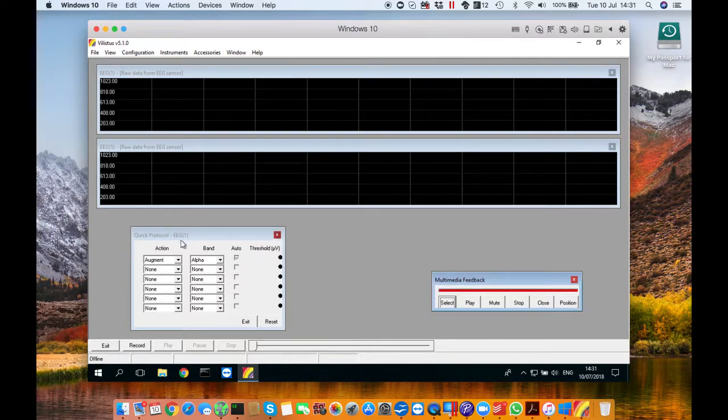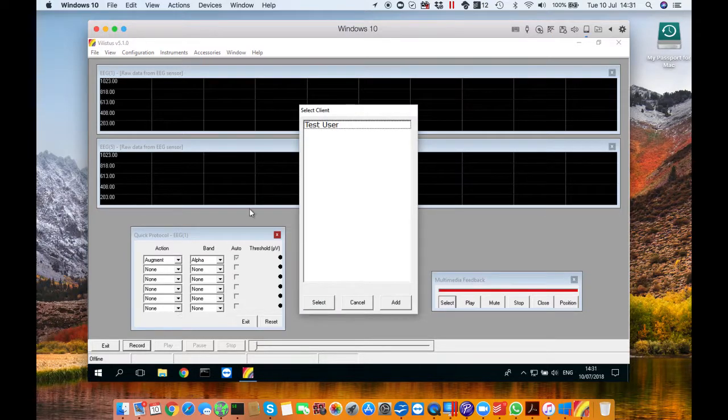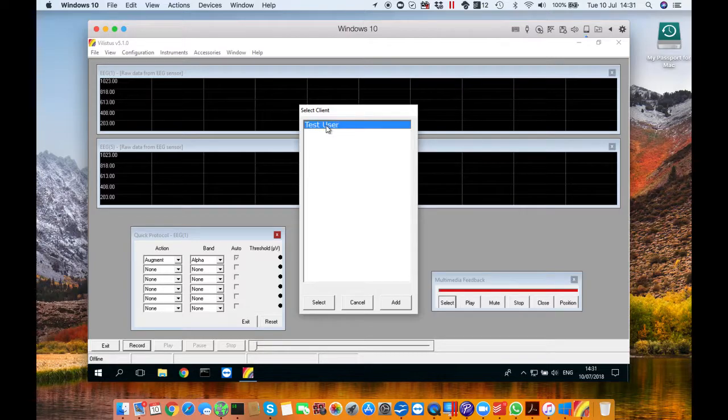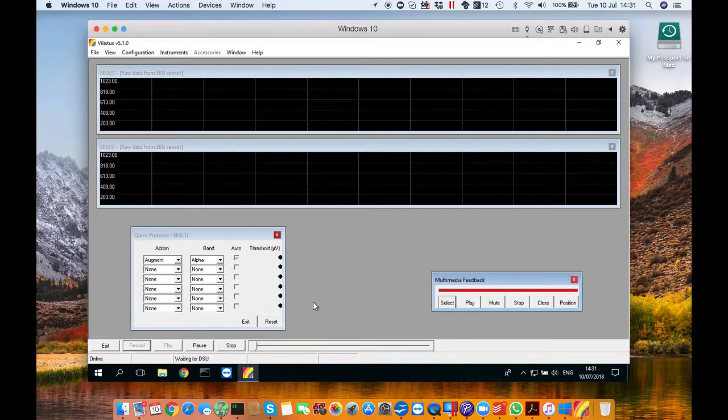So now press record and this little window will come up where you have to select who's doing the session. You can add your name by using the little add button at the bottom or you can click on test user. But once you've clicked on a name or test user press select and the session will start.